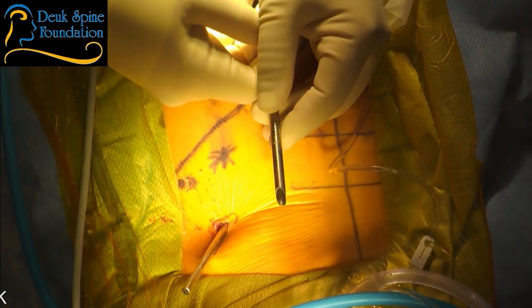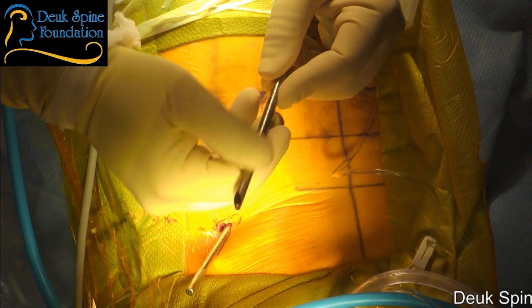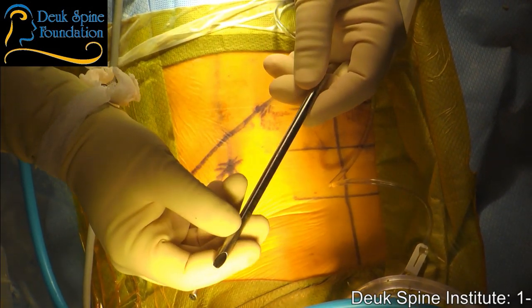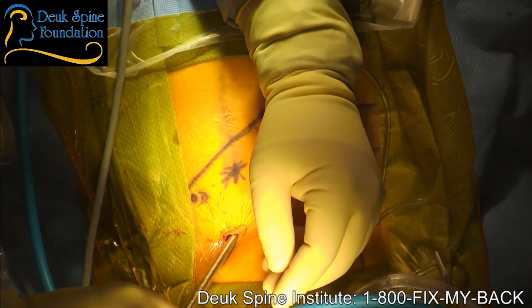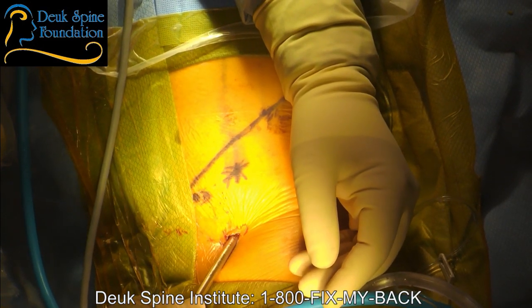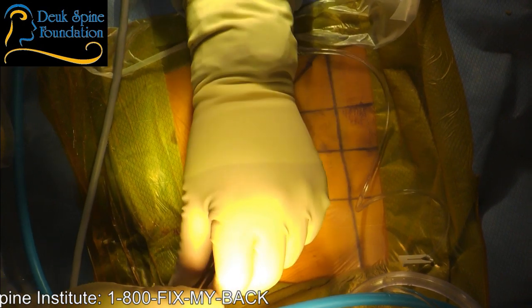Zach? You see this tube? We can see it. So the whole surgery is done through this little tube. I call it the milkshake straw tube. And it's really tiny. And of course, there's no bone removed from the spine like other surgeries. So no big incision. It's a 7 millimeter incision. The outer diameter of the tube is pretty much 7 millimeters, and the incision is 7 millimeters.